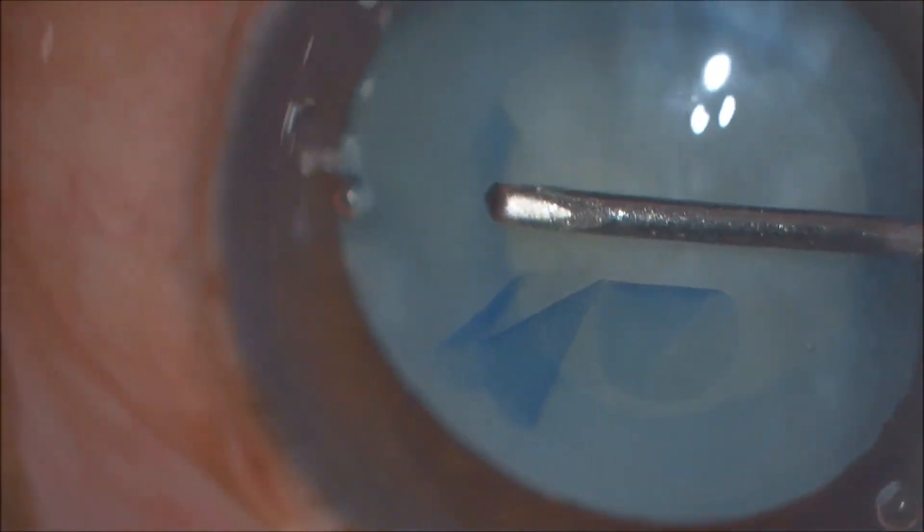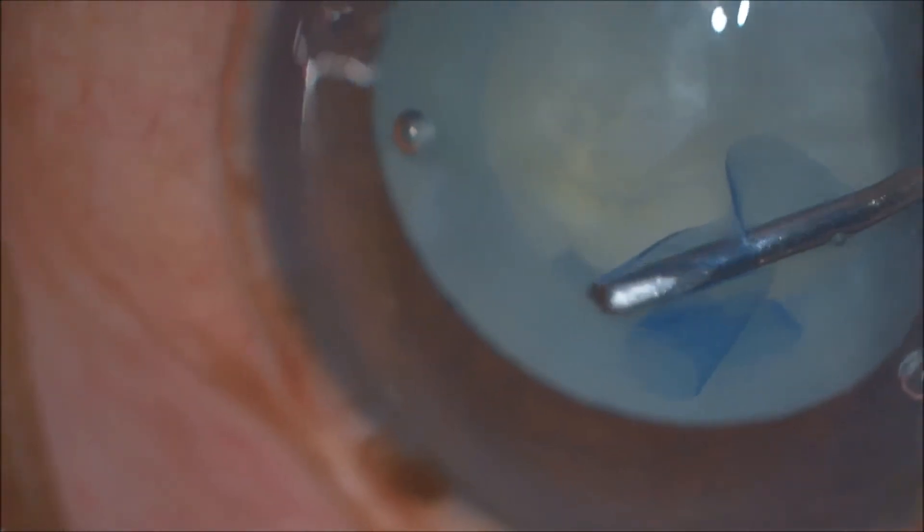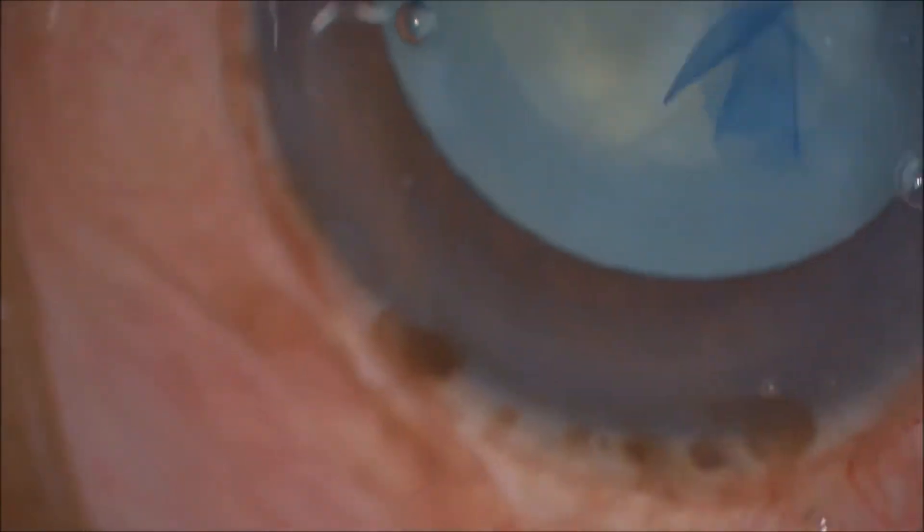While extending, make sure that you always hold only the tip of the extended capsulorexis, and the direction of force should always be centripetal.